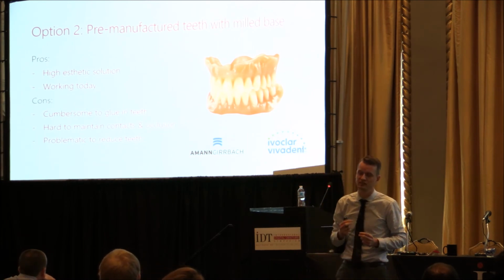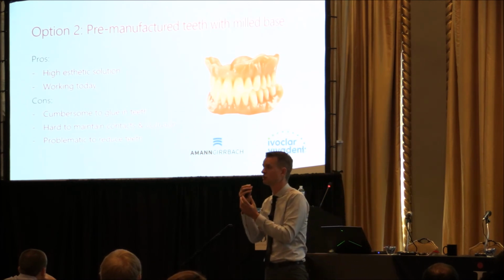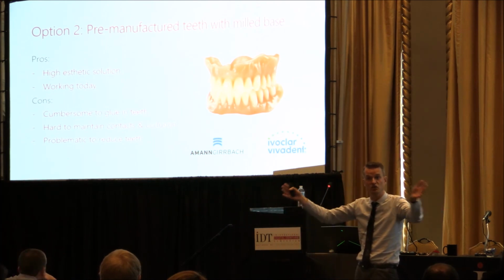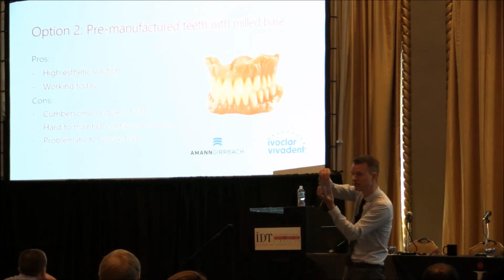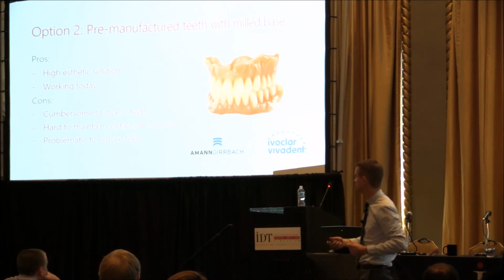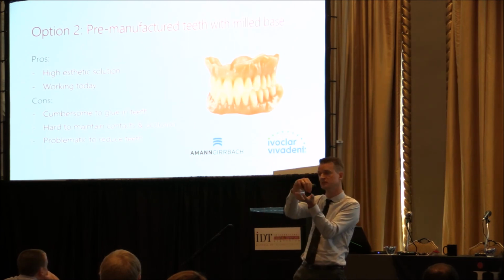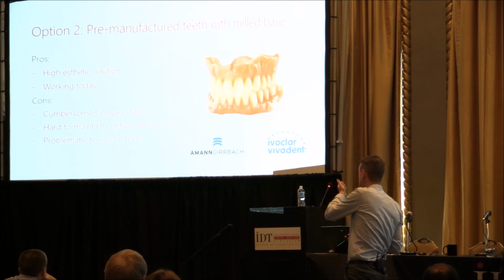The main problem with denture teeth today is that they are not produced very accurately. Because they are molded, molds are old, different molds have different sizes, so denture teeth vary in size. And when you have a very precise CAD/CAM milled pocket, it's hard to glue them in. It's very hard to maintain contacts, hard to maintain occlusion. You can't do the guide.